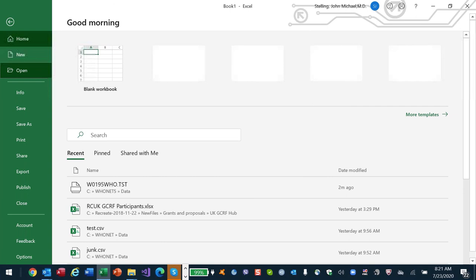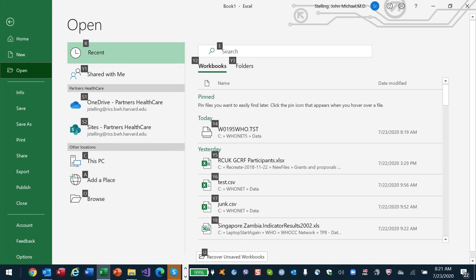So I'm going to say replace or replace all. So we've replaced all of it. So you have the options: replace them one at a time, replace all, or you can just do find next. Some of these features that are extremely valuable in Excel, we will start to put them into WHONET: filter, find, replace, replace once, replace all. So some of your cleaning, like the 001 issue, I would suggest to wait until we have that replace feature.